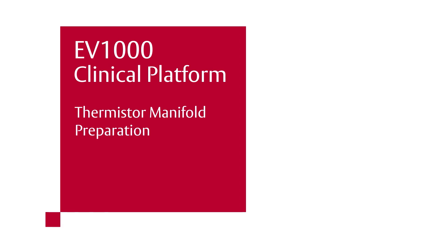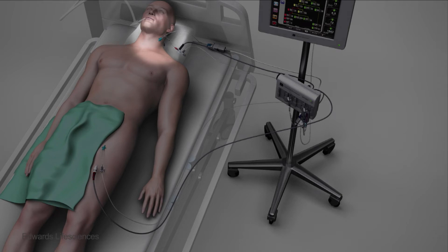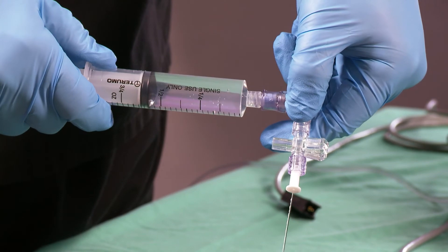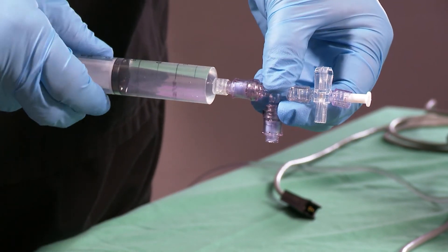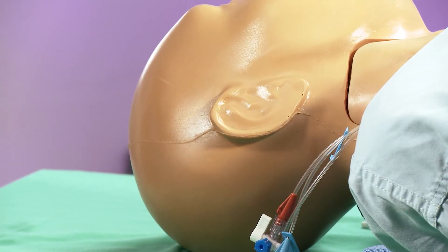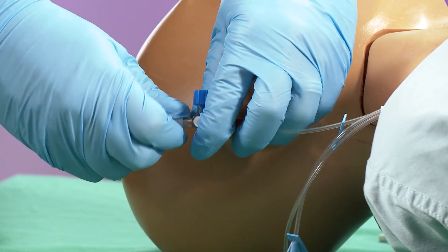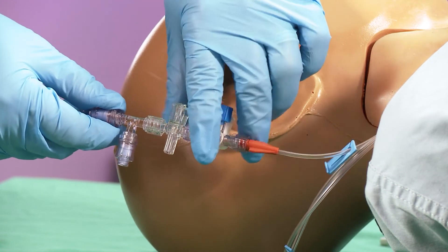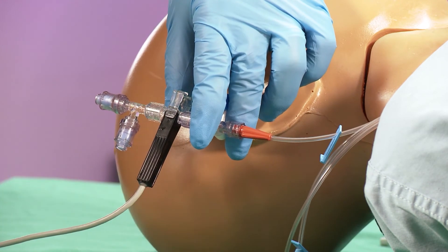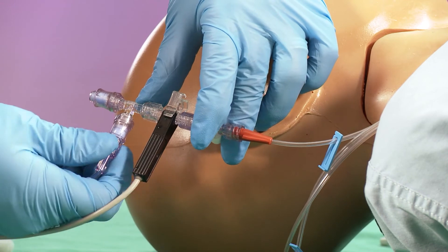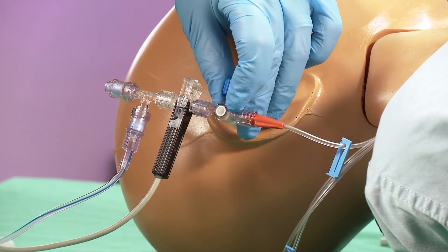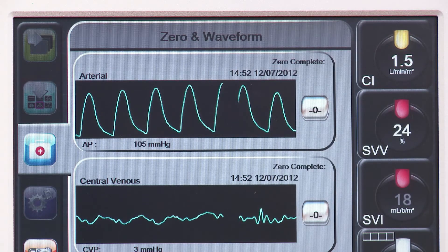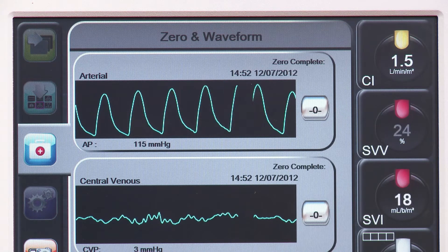Thermistor manifold preparation. Before priming the thermistor manifold, confirm the proper placement of the CVC. Prime the thermistor manifold with normal saline using a luer lock tip syringe. Prime both ports to evacuate air. Connect the thermistor manifold to any port of the CVC catheter. Connect the inline thermistor cable from the EV1000 clinical platform to the inline thermistor manifold connection next to the CVC pressure transducer port. Connect the CVC transducer pressure tubing to the side port on the thermistor manifold. The free port on the thermistor manifold is used for the syringe containing the TPTD bolus. Confirm that the appropriate CVC pressure tracing and reading is on the EV1000 clinical platform and the bedside monitor.